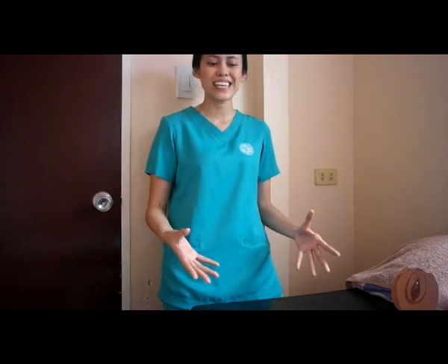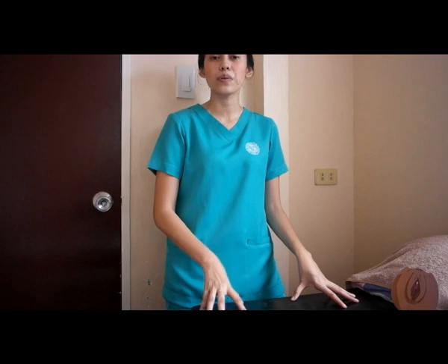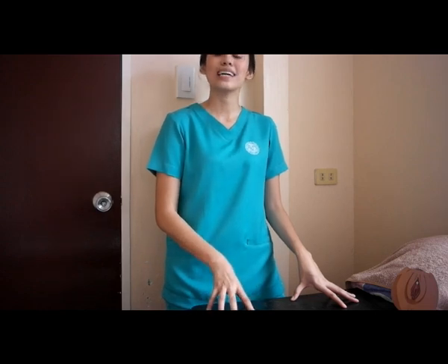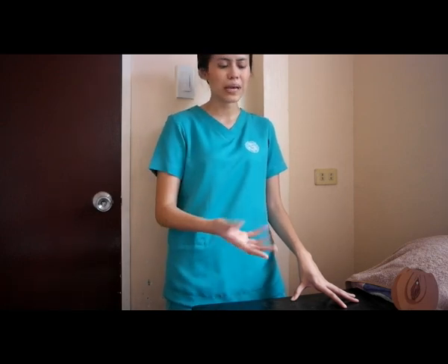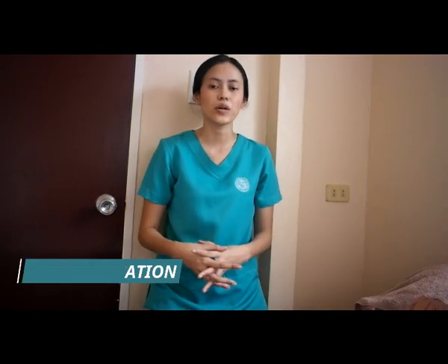And as far as you can see, I don't have here a real patient, but ideally the position of the patient should be supine with their legs extended and slightly abducted. And the rationale to that position is to have easy access to the urethral meatus and to successfully perform the catheterization.